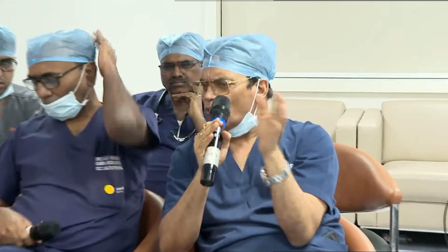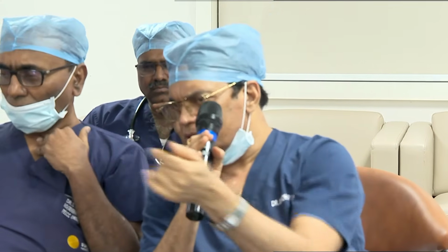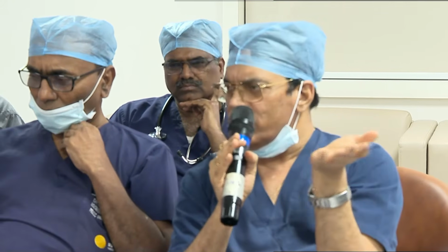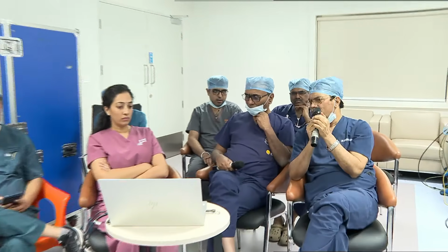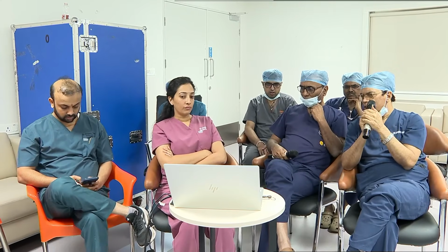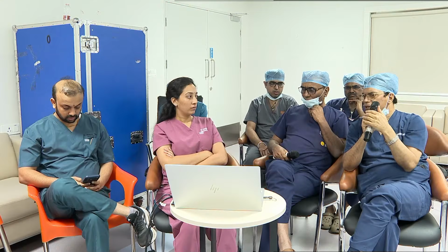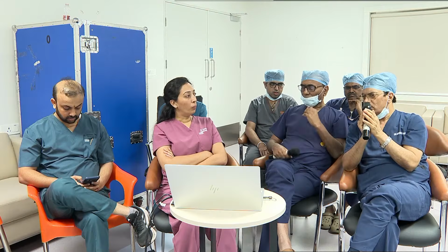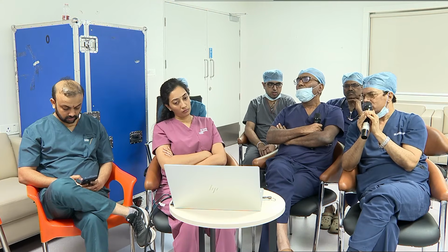Suppose the right coronary is there, only one vessel. You are very sure there is a big cell, you can access very easily, roomy sinuses, height is very good. After that, if you want to, always try to protect the coronary artery. Keep the wire inside the coronary artery. If needed, you can keep the guide liner and access the coronary artery, and through the guide liner, maintain the stent. If suddenly it closes, you should be able to put the stent and implant it. It is a life-threatening situation.